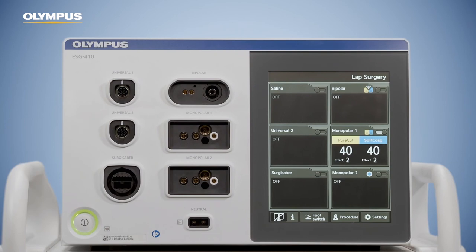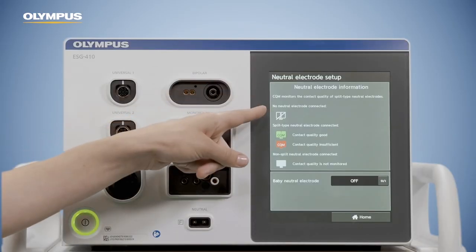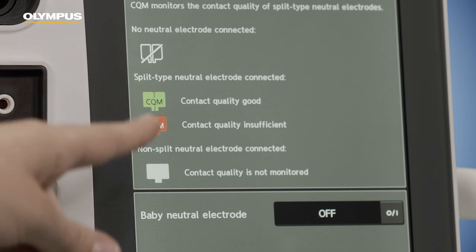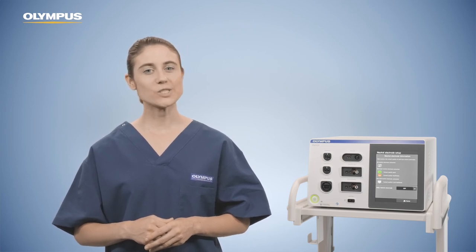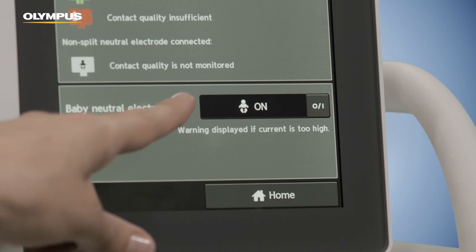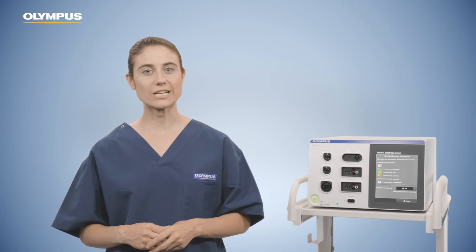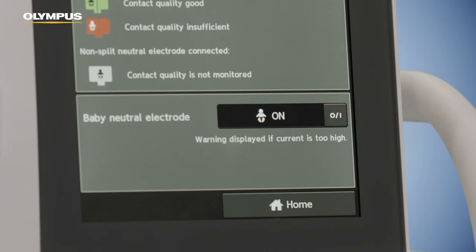The ESG 410 provides a feature to permanently prevent the use of non-split neutral electrodes, which can be set up in the maintenance area. The neutral electrode screen provides an overview of the neutral electrode icons: an empty icon if no neutral electrode is connected, green or red states for split neutral electrodes, and a gray single pad icon for non-split neutral electrodes. It is also possible to use neutral electrodes for newborns — switch on the baby neutral electrode function to help avoid burns to baby patients. The CQM indicator changes accordingly and shows a little baby icon. If too much current flows through the neutral electrode for newborns, resulting in too high temperatures at the baby's skin, the user is warned by an alarm tone and an error message. Please follow its instructions.